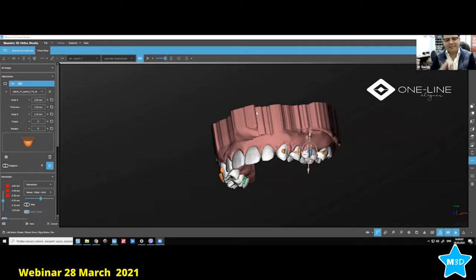So remember, aligners are push. If there is no push from the sides, it will not work. If you just push here, it will just go up on the posterior, it will not work. You're pushing here and there's no retention, so this will go up. This will not push down. It's very simple.